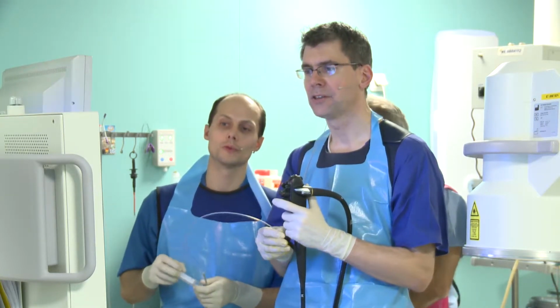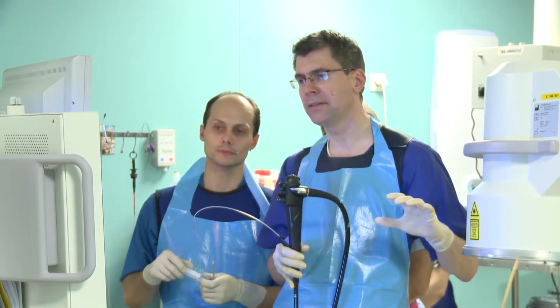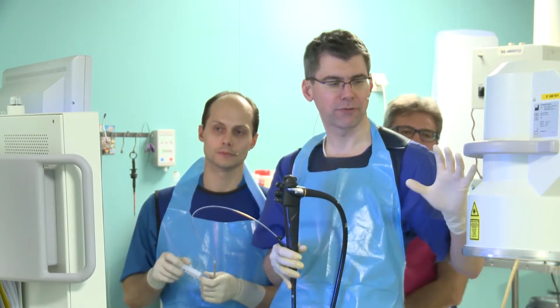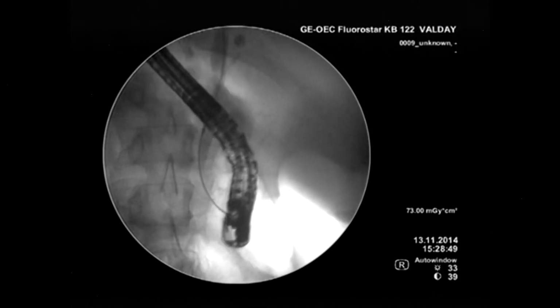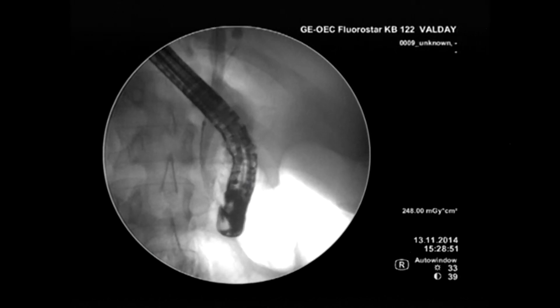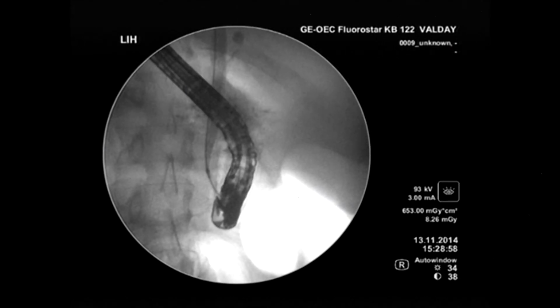Okay, we performed ERCP and we saw the intrahepatic ducts already. Now in the time we were away, we've rotated the X-ray machine a bit, so now we can see the common bile duct properly. And when we inject here, you see that in the upper part above the scope there's a fairly smooth wall, and down here in the intrapancreatic portion you see that there's a narrowing of the duct. This can of course just be the intrapancreatic duct, as we discussed earlier, but in this case I've got difficulties even bringing the catheter up.